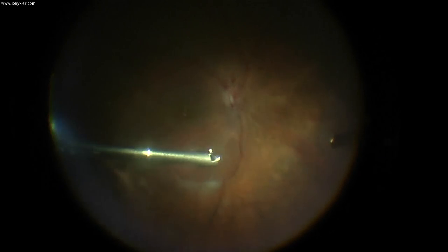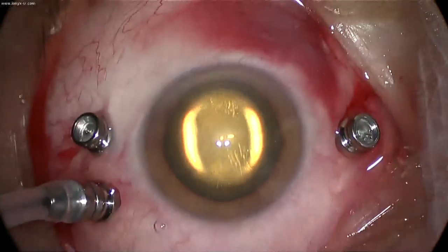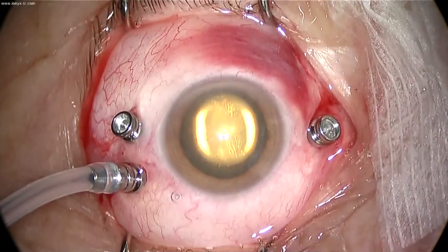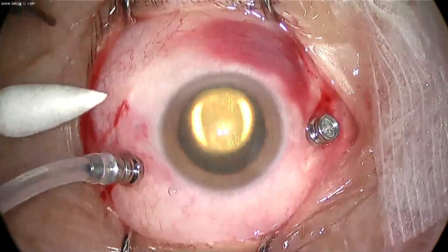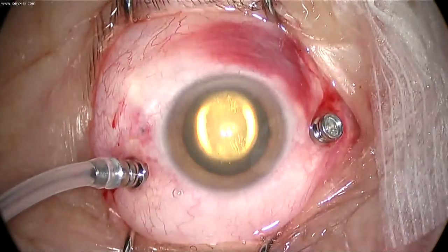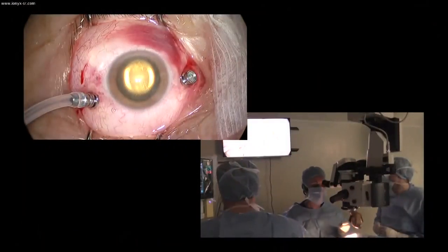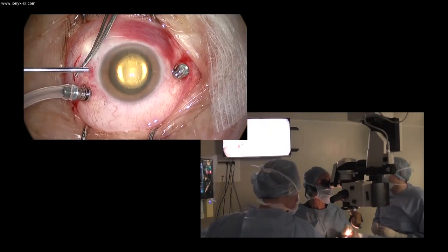So I put some air just to ease the closure of the sclerotomy, but I will leave it with a slight hypotony. I close the sclerotomy anyhow with diathermy.